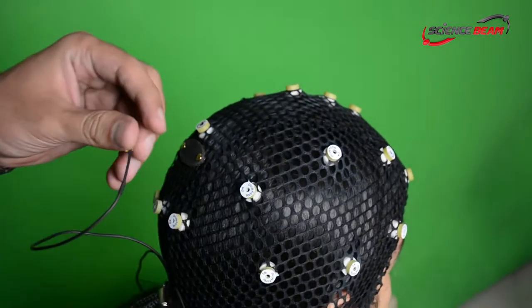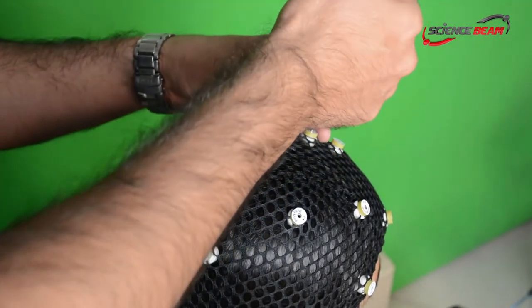These are the feedbacks that brain receives during the neurofeedback therapy.